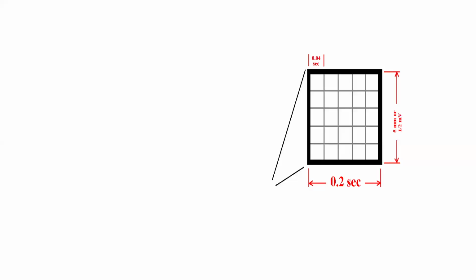Maybe I need to pause there and ask then, if this stylus pen is moving at 25 millimeters per second, how many millimeters or how many small boxes would it have moved in 60 seconds? You can interact with us even as we continue on the Q&A and even the chat box. So then, 25 millimeters per second, and we have just said one small box is equivalent to 1 millimeter. For you to get 0.04, it means it is one small box divided by the 25 small boxes, you'll get the 0.04.